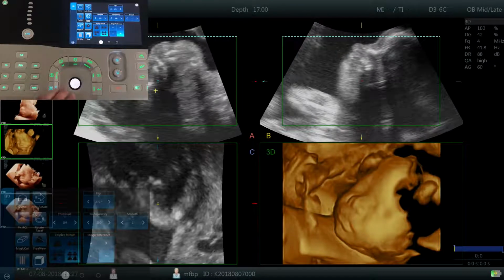So having a look at this image, I can see a couple of things by looking at the 4-screen view. First of all, I can see that it's not the ideal, in this case they've taken the profile face on rather than taking the profile side on, which is what we've got here in the other axis. So it's not the ideal view to begin with, but it's okay, we can manage this. I can see that baby's forehead is cut off at the top here, and that's why we can't see it down the bottom here.